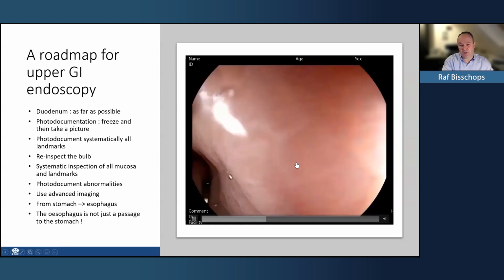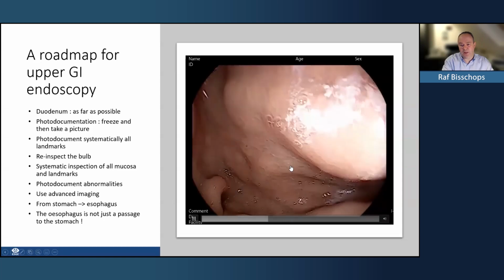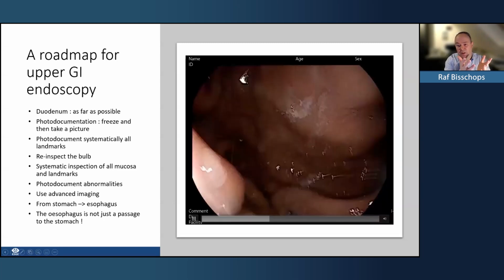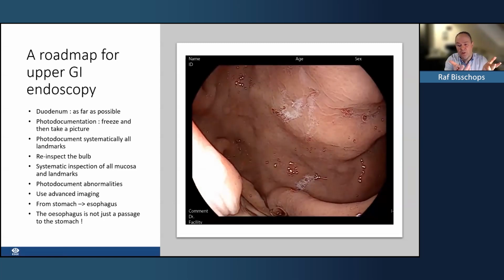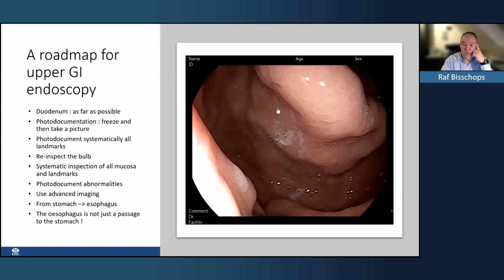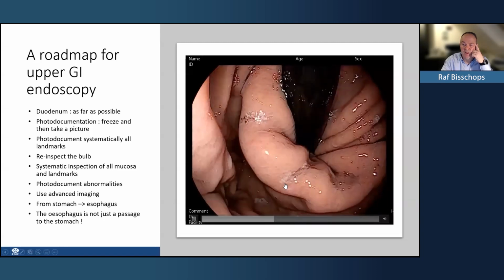And again, you took a picture of that. Then it's time to inspect the full fundus, aspirate and insufflate. It's also something I very often do simultaneously. When I apply suction, I also insufflate, not to lose all of the insufflation. Still a little bit of mucus here, but we can accept that, I think. And you can see nicely here the fundus.